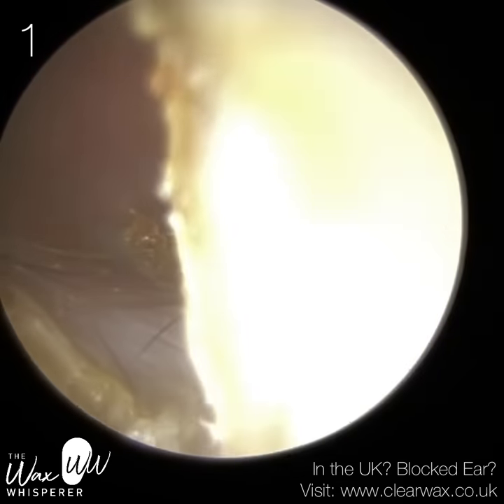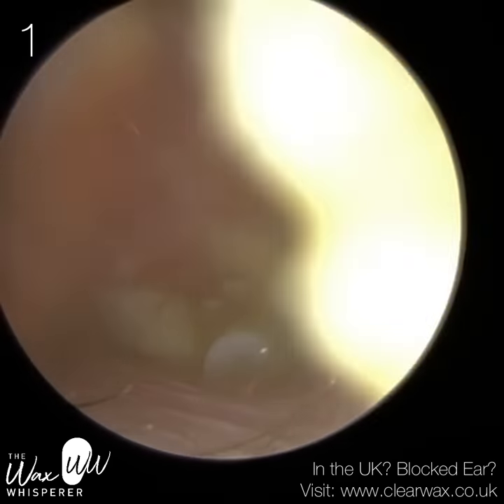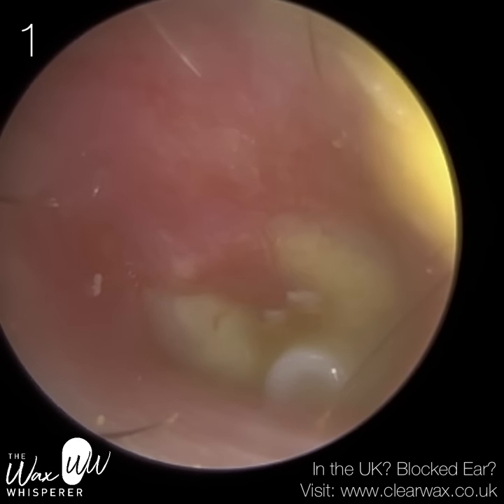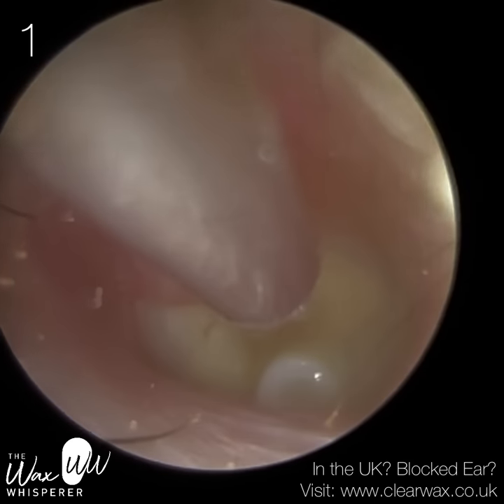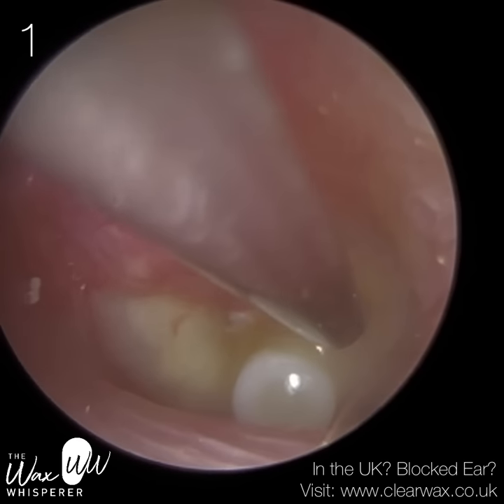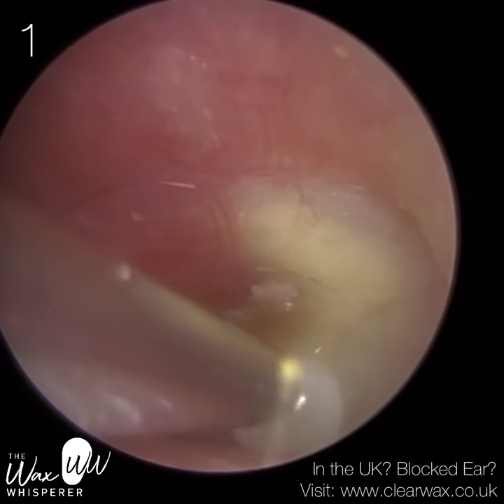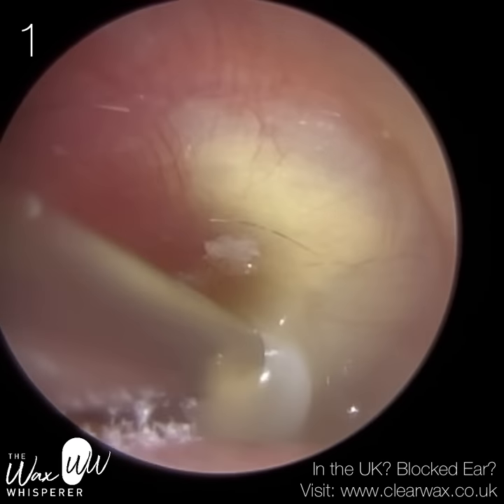This is her first appointment — she visited me a couple of weeks ago. Now you can see we've removed all the debris, all the wax, all the keratin that was occluding the ear. And in the distance is her eardrum — this is her left ear.